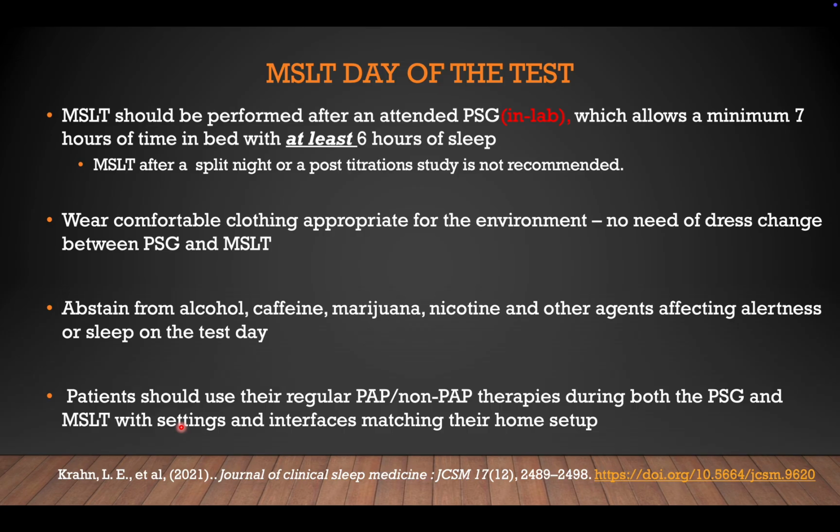Abstain from alcohol, caffeine, marijuana, nicotine, or other agents affecting alertness or sleep on the test day, and the patient should use their regular PAP or non-PAP device, for example the MAD, mandibular advancement device, during the PSG night before the MSLT and during the MSLT naps. And it has to be recorded or documented in the patient file.